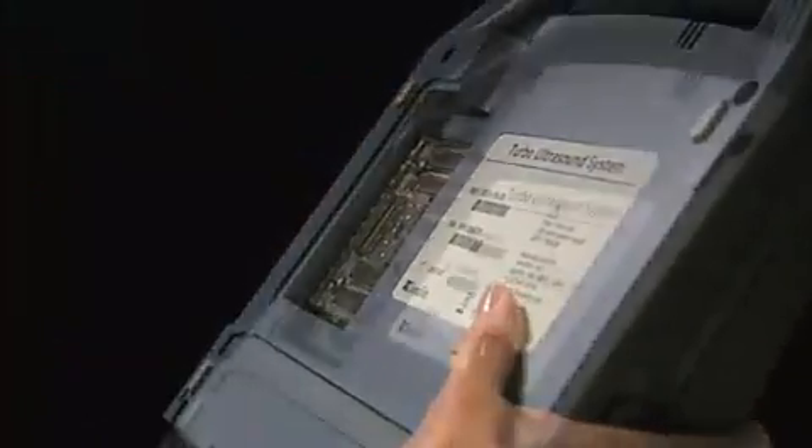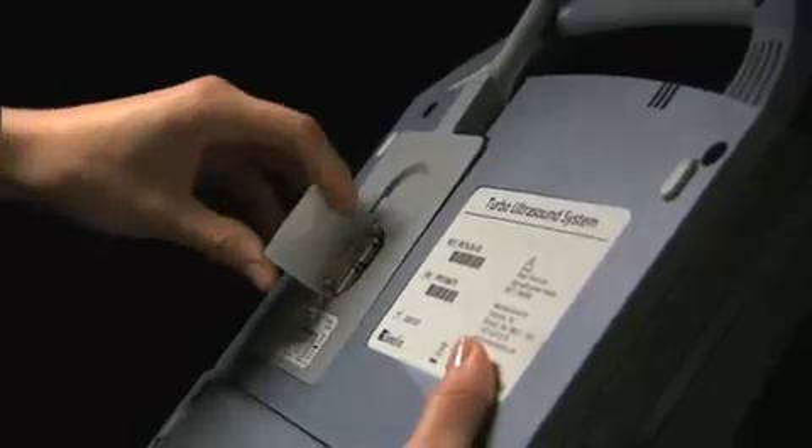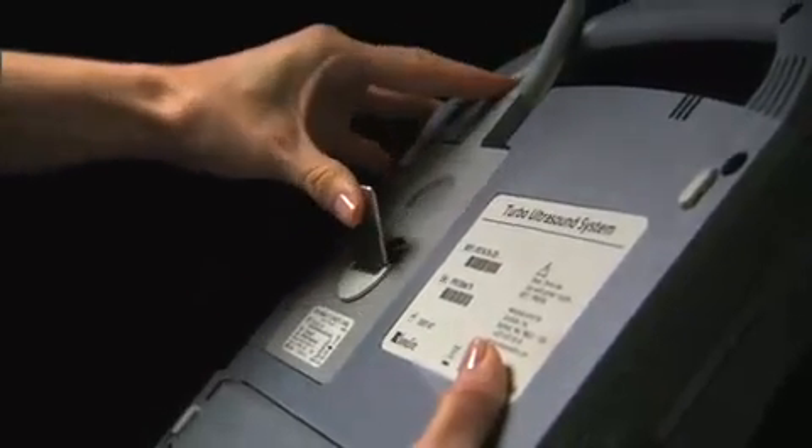To connect a transducer, turn the system upside down. Pull the transducer latch up and rotate it clockwise. Insert the transducer connector, then turn the latch counterclockwise and press the latch down to secure it.